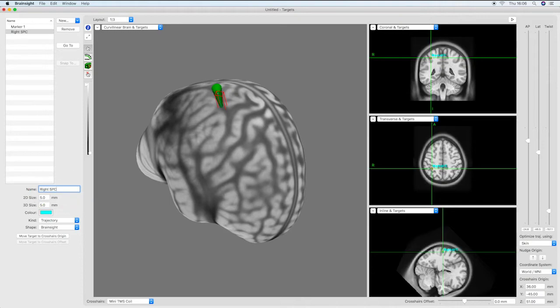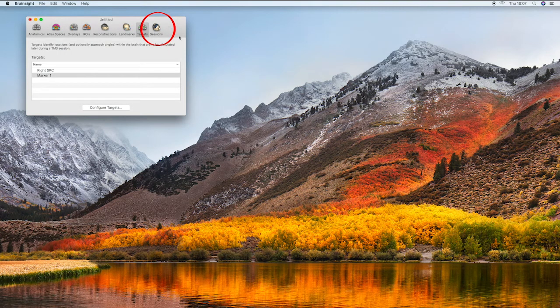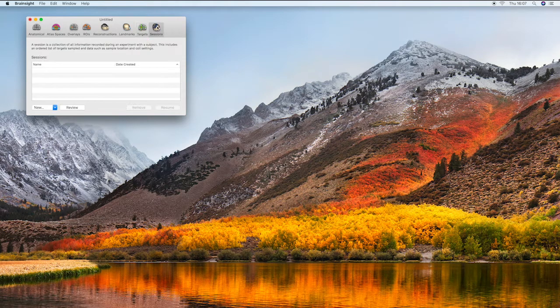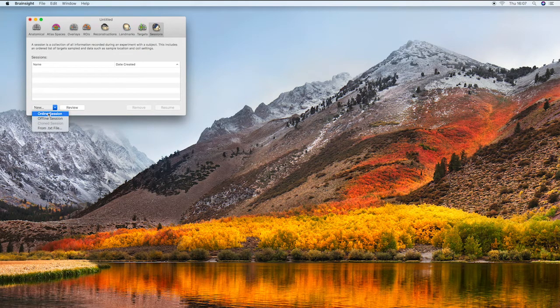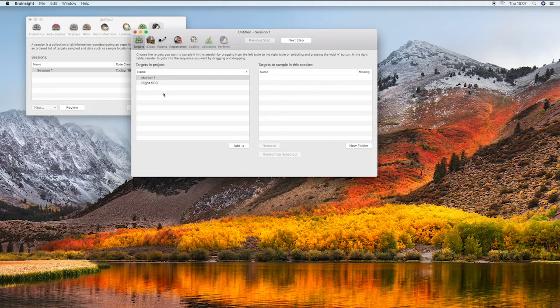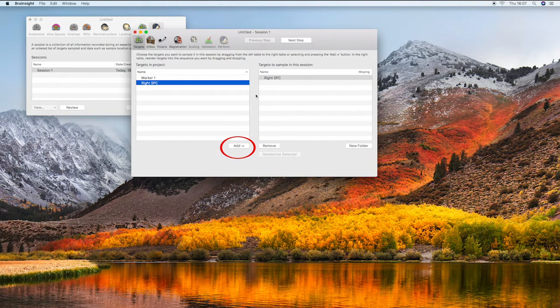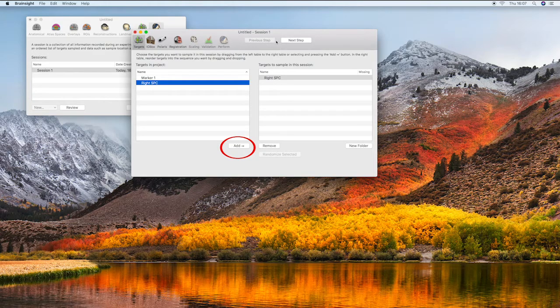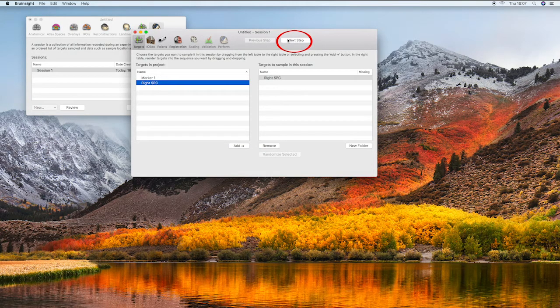Having saved your target, close the targets window and proceed to the sessions tab. To start a new session click new then online session. You must now add the target required for this session. Select the desired target and then click add, or simply drag it from the left hand column to the right hand column. Click next step to proceed.